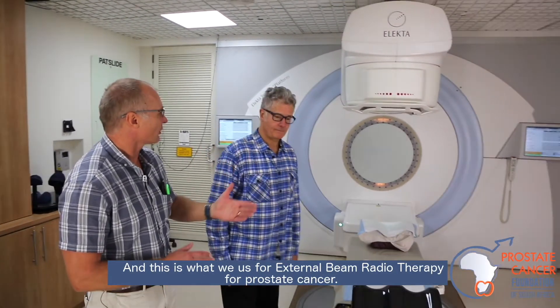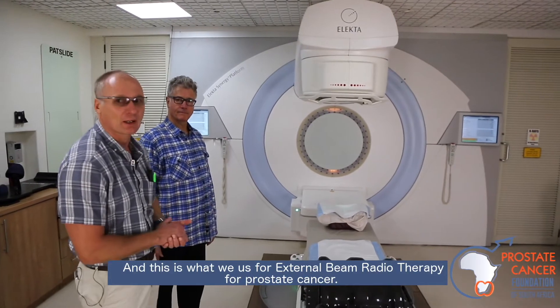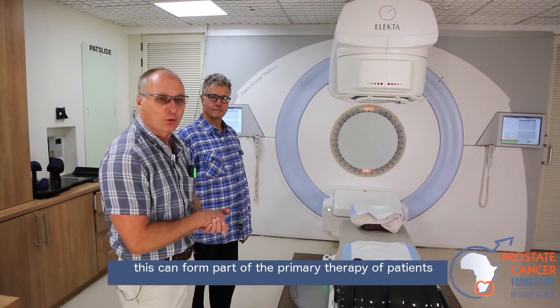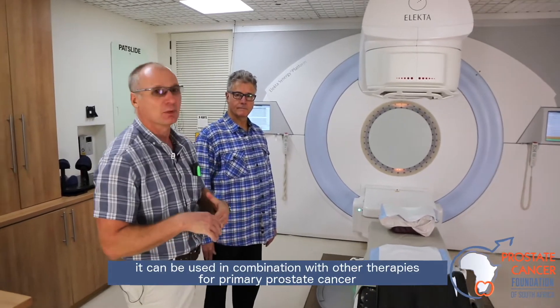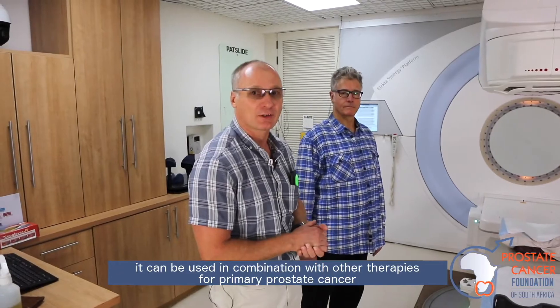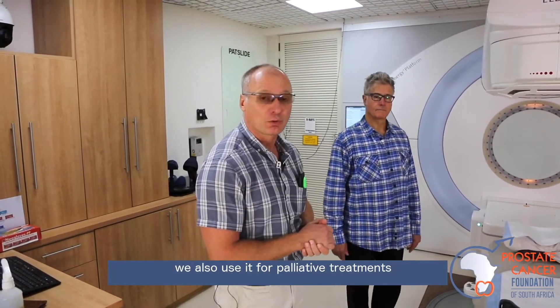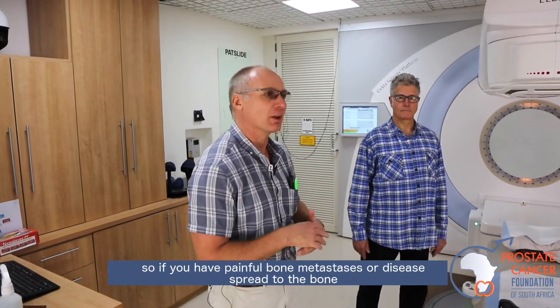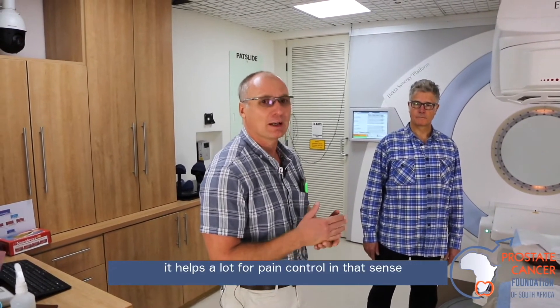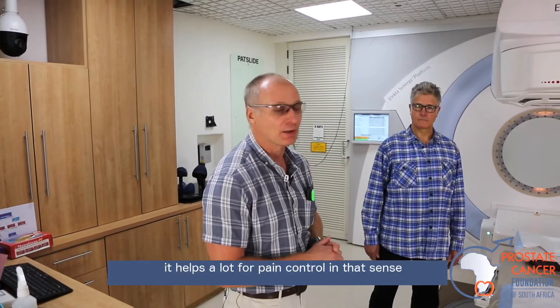This is what we use for external beam radiotherapy for prostate cancer. This can form part of the primary therapy of patients, and it can be used in combination with other therapies for primary prostate cancer. We also use it for palliative treatment — so if you have painful bone metastasis or disease spread to the bone, it helps a lot for pain control.